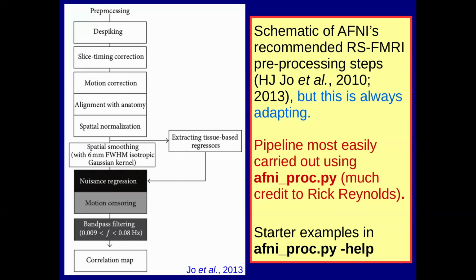It's not just poof, picture of the brain, and 2 seconds later, poof, another whole picture of the brain, but we're actually acquiring bits of it over time for 2 seconds. So a slice here, then here, then here, and for that entire 2 seconds, we're filling up the whole volume, and then we start that process again. That process doesn't just go slice by slice through the brain nicely. It usually interleaves or uses more complicated patterns just because of the physics.